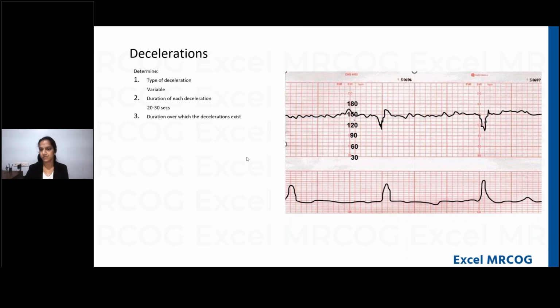Yes, Dr. Aparna. Yes, ma'am, for 1 centimeter per minute, I know that the small square is 30 and two small squares are 1 minute. But can you please explain in this CTG what corresponds to the small square? I'm confused with how we calculate in this one.